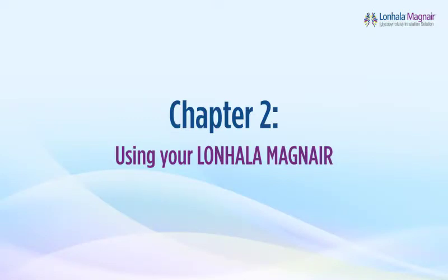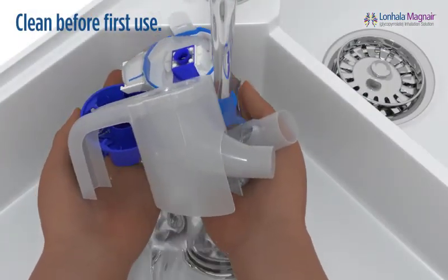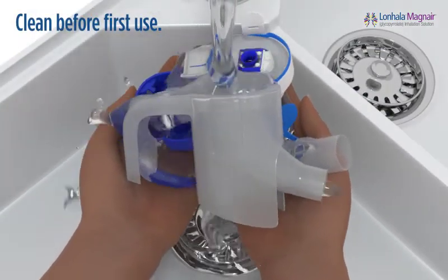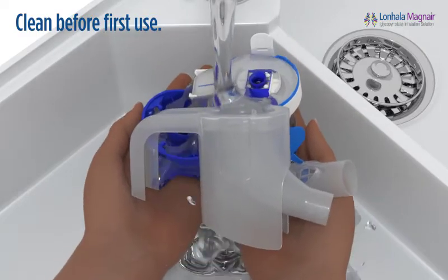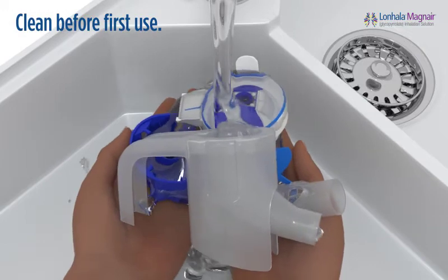This chapter will review how to assemble and use Lonhala Magnair. Before using your Magnair nebulizer system, please also read and understand the manufacturer's instructions for use included in the Magnair box. Before you use Lonhala Magnair for the first time, it is important to clean all the handset parts. Skip ahead to chapter 3 of this video to review cleaning if you have never used your Lonhala Magnair.